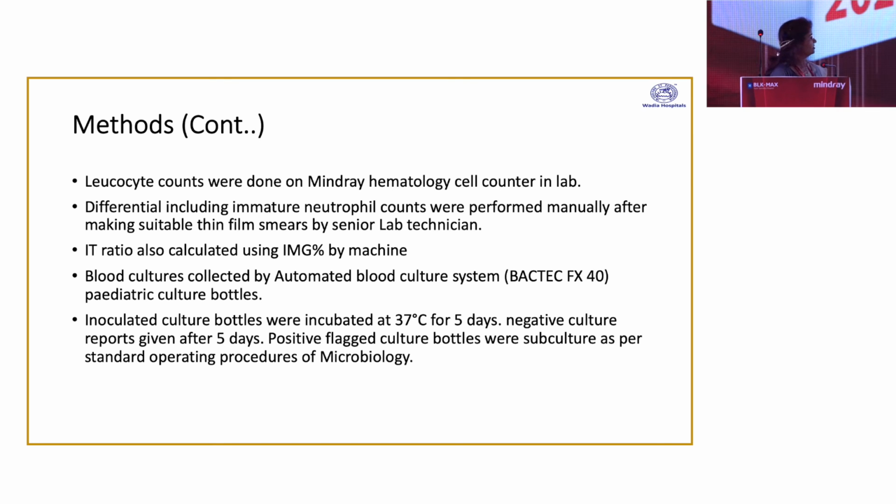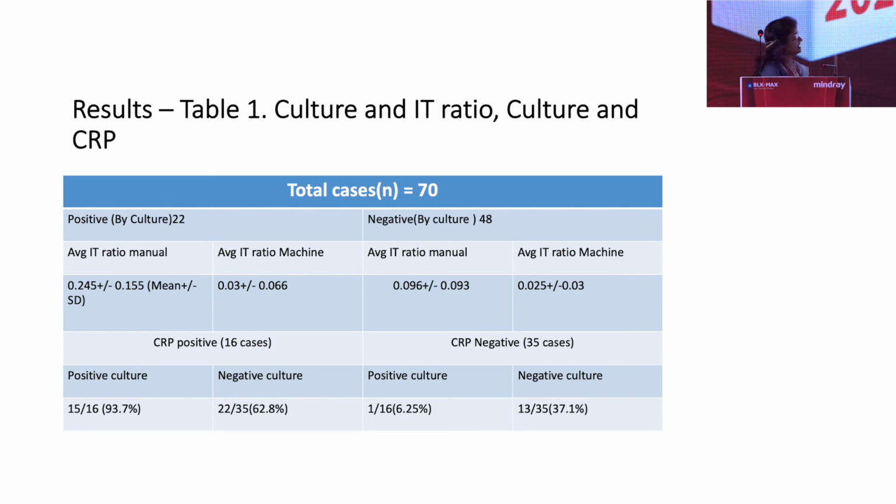At the same time, inoculated blood cultures were incubated at 37 degrees for 5 days. Negative culture reports were given after 5 days. Positive flagged culture bottles were subcultured as per the SOP of microbiology. So we had 70 cases. Positive by culture were 22 and negative were 48.